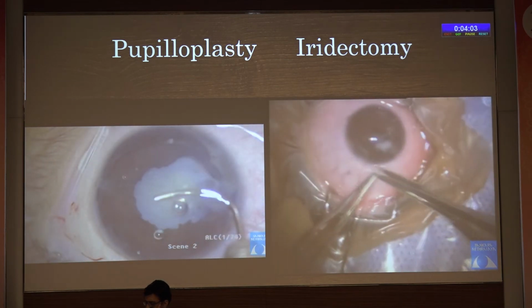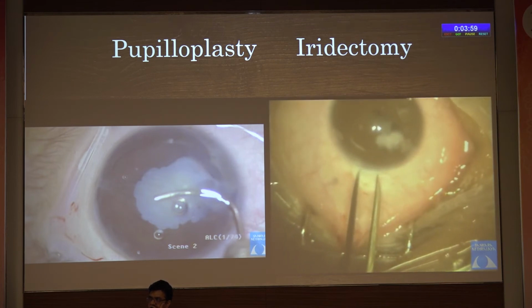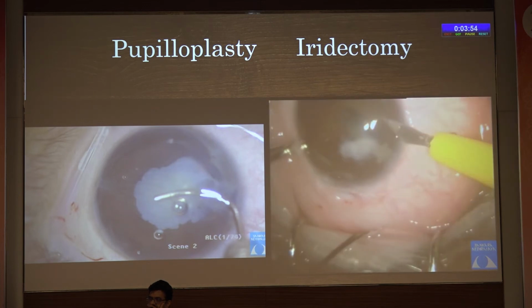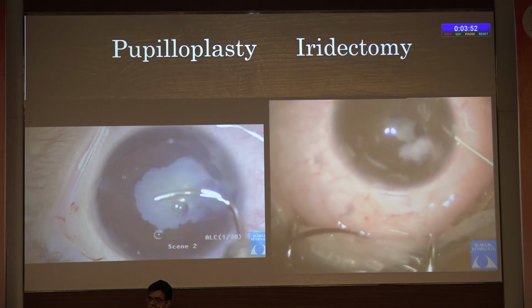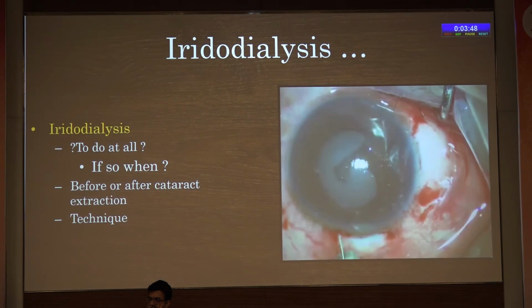In this second situation, you see a corneal opacity almost touching the center, but there is a good peripheral clear cornea, so you can utilize that area. As you do the cataract surgery, you can do an iridectomy to enlarge the pupillary opening to get better clear visual access. And here we see iridodialysis.